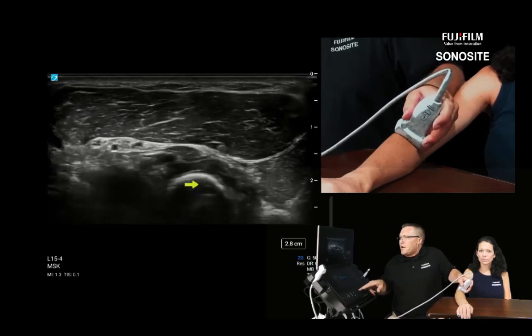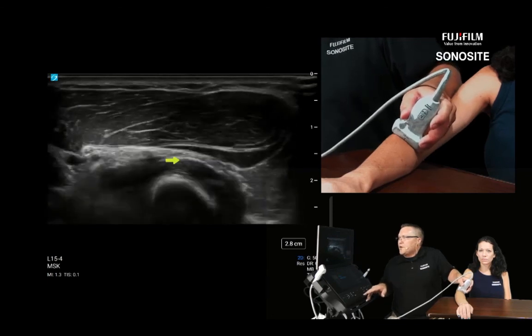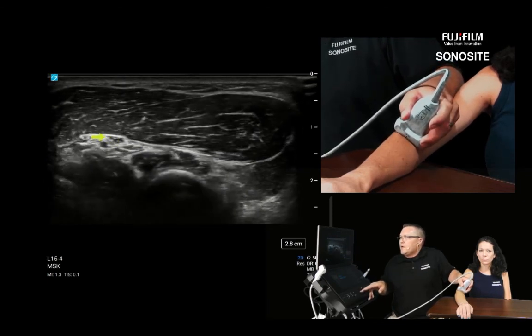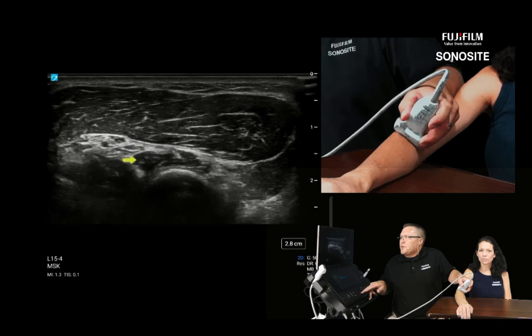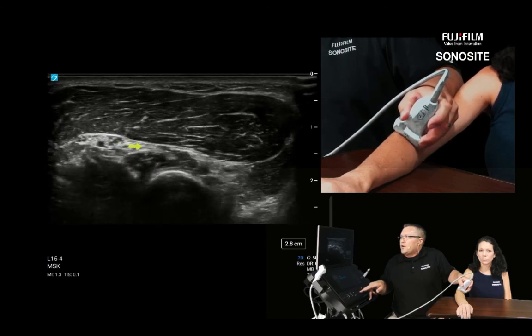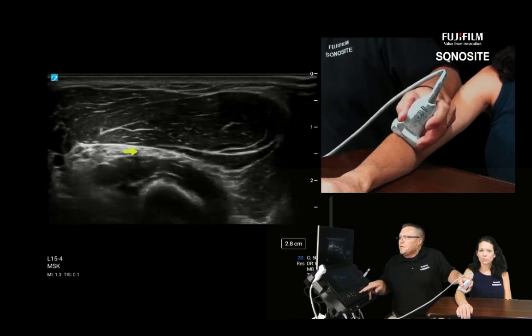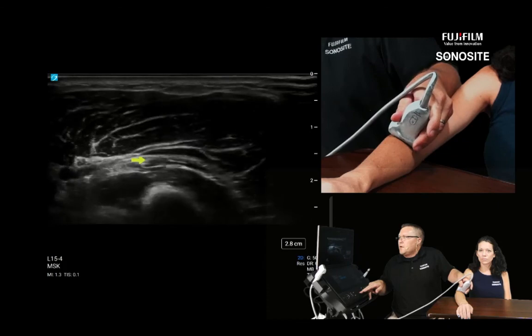Now over that radial neck, we start to see pockets of the supinator showing itself right here. So when I start to see the bulk of the supinator show itself, I'm looking at this branch about 3 o'clock on the image, and we're going to watch it follow the fascial plane down to the supinator. Everybody see that right there? Follow, follow, follow. Now we see the supinator.